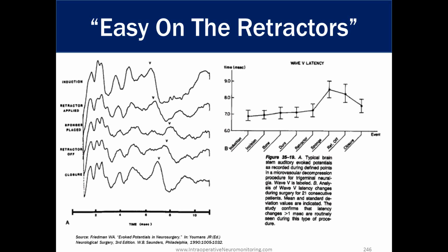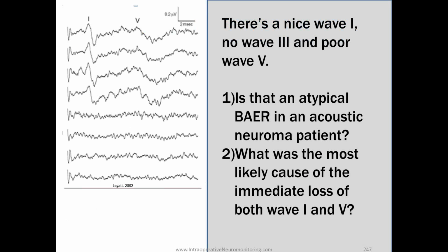He may then elect, or she may then elect, to continue on with the procedure, but do much less retraction in order to see that, or hopefully he's already ordered some of these diuretics to make sure the brain swelling is down a little bit, because it's probably going to be too late at that point, to tell you the truth.